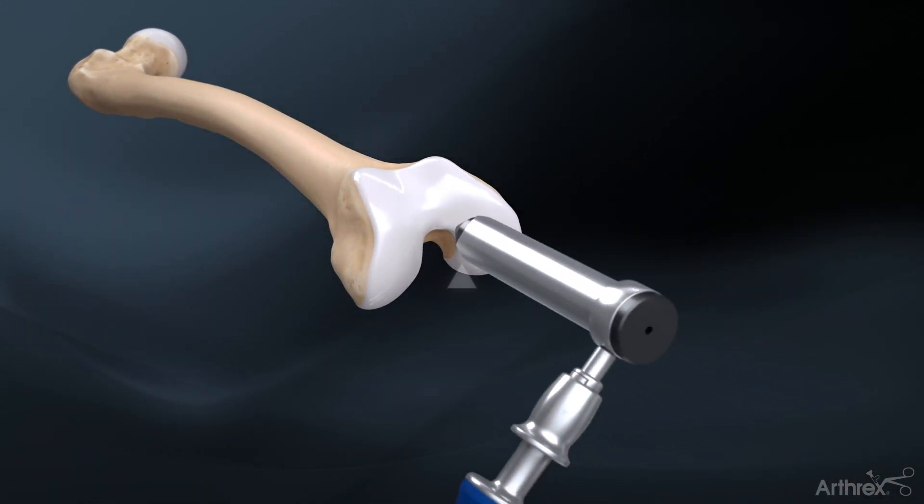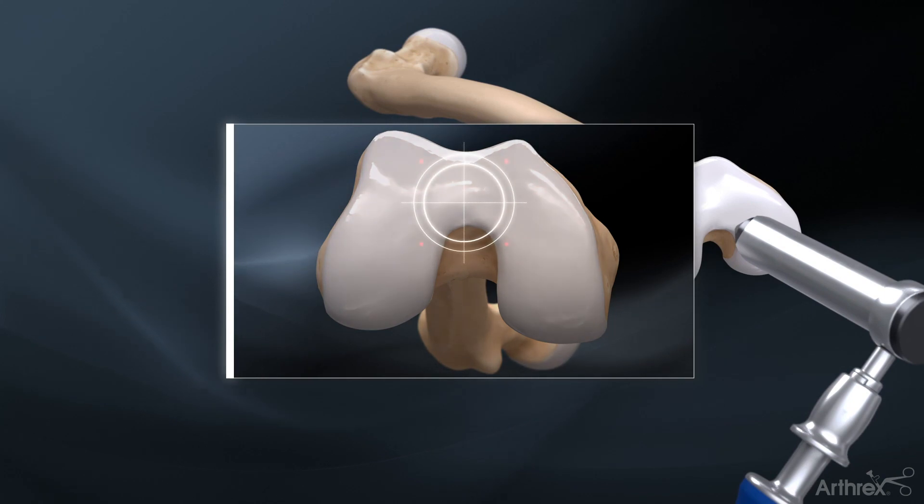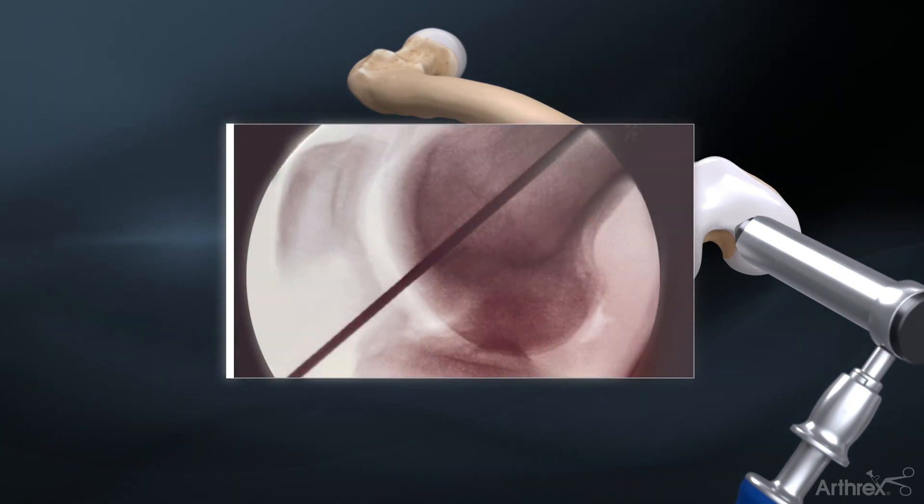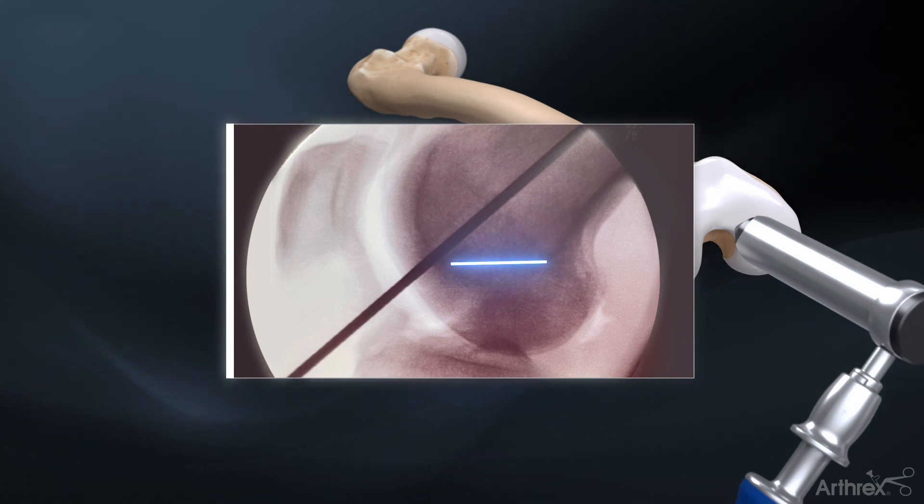Determine the entry point for the nail located in line with the femoral canal in an AP view, and just anterior to where a Blumensatz line intersects the anterior intercondylar notch on a lateral view.